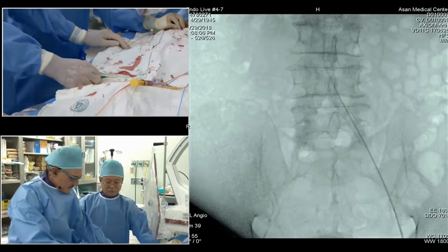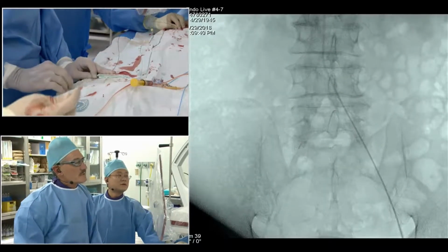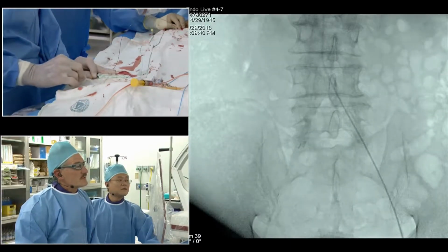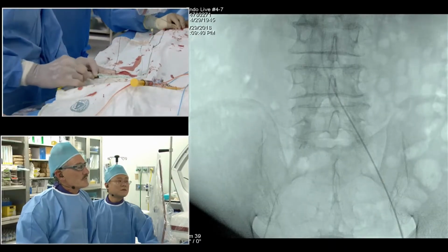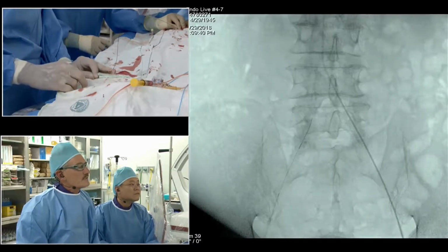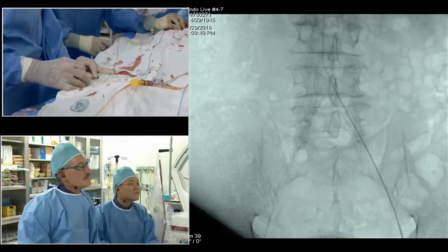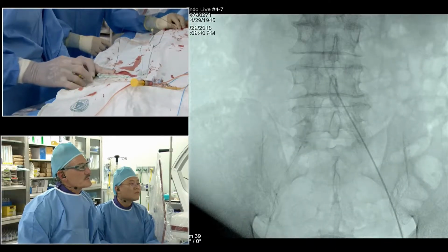We ran through the CT fairly quickly, but there's one segment where it becomes quite eccentric, and I think we have to do almost like a spiral turn to get around it, which may make it really hard to do retrograde. So we'll continue here because if it goes, it makes life easy. But if it doesn't, we'll switch over.